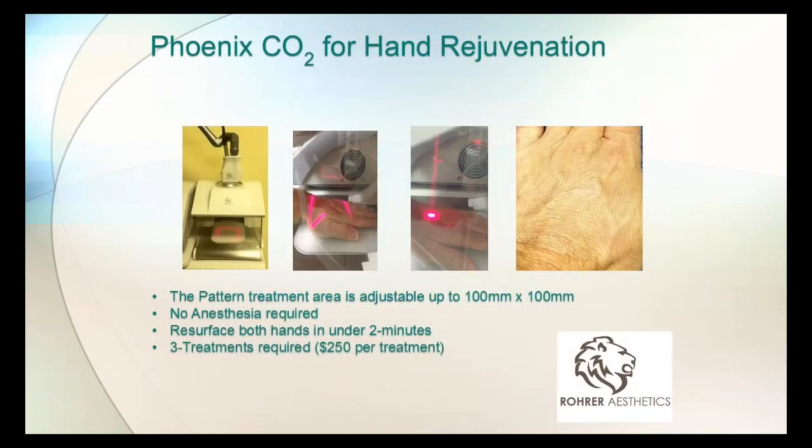And Mark, can I comment on that? Yeah, please. Yeah, this, my practice is truly 99% facial. But this is a very popular add-on thing we do in our practice. As Mark says, patients actually love this. I think this rejuvenates their hands, and we will do portions of their arms with this. And I think it rejuvenates things better than injecting the dorsum of their hands with any materials, because it helps the pigmentation and it will tighten the skin.